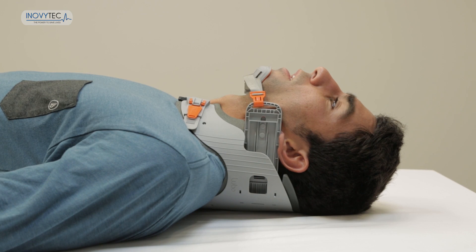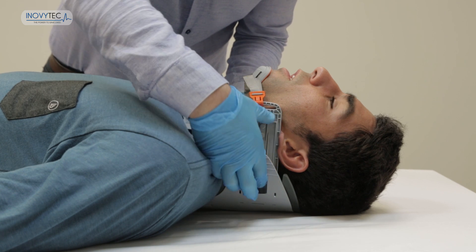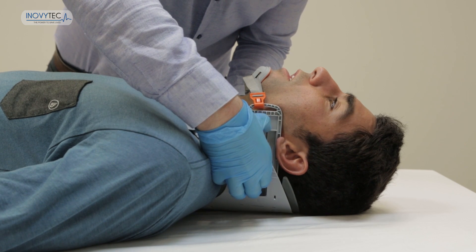If the patient regains consciousness, you may release the mandibles backwards by inserting your finger into the port, lift to unlock it, and return them backwards.